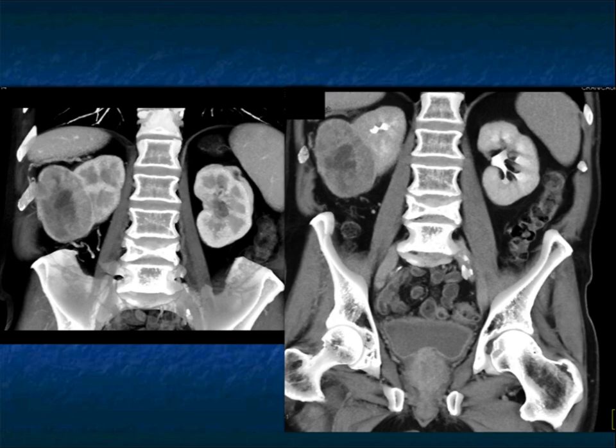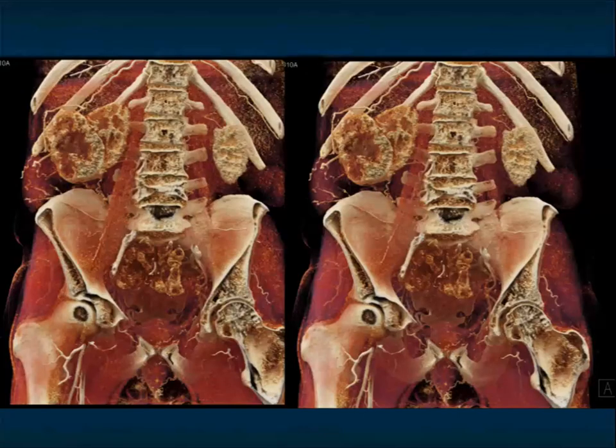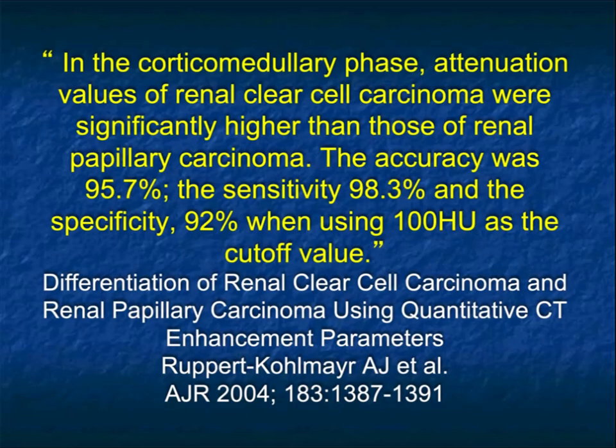The capsular component is often seen and, while not all that helpful in determining resectability, it is useful information for the surgeon particularly with smaller tumors when thinking of partial nephrectomies. And here is the cinematic rendering of that mass.